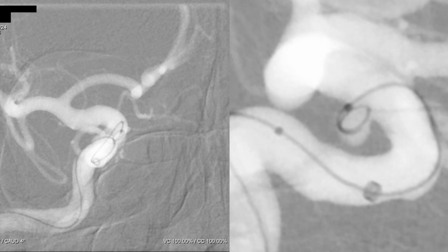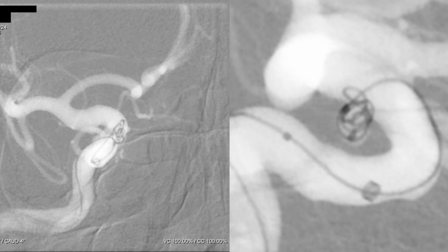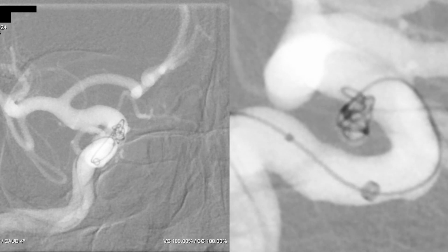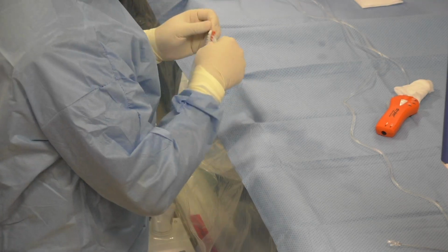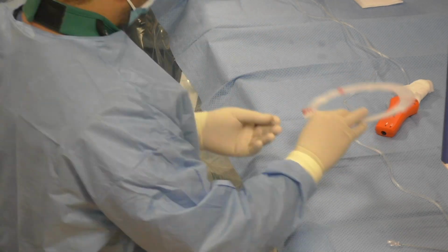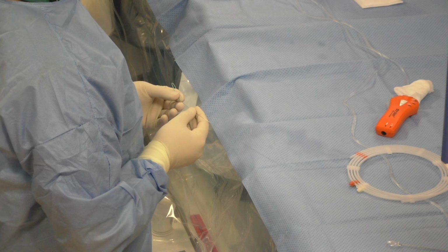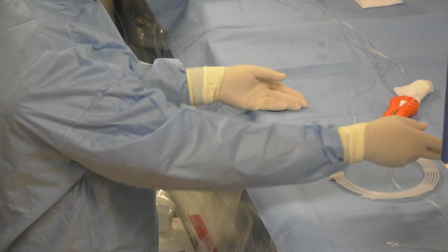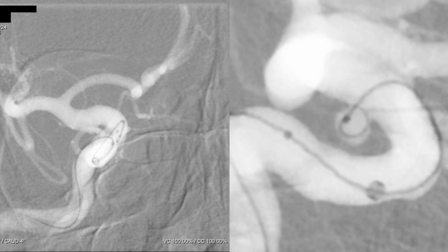As you can see, we were a little bit outside of the aneurysm, and with the help of the coil, we could bring the microcatheter into the aneurysm sac. As you can see, it's not stable because the coil is a little bit big. And here we're taking the smaller one. It's also a Tetra coil from Target.